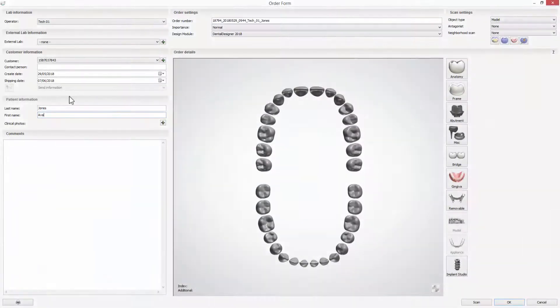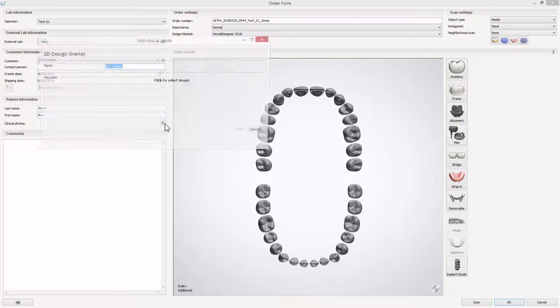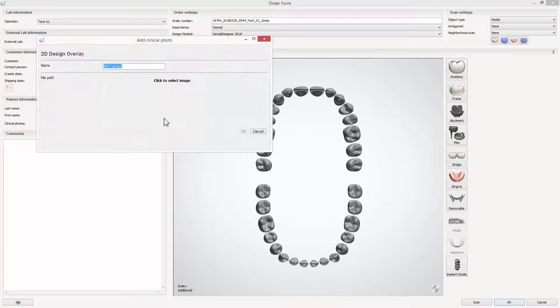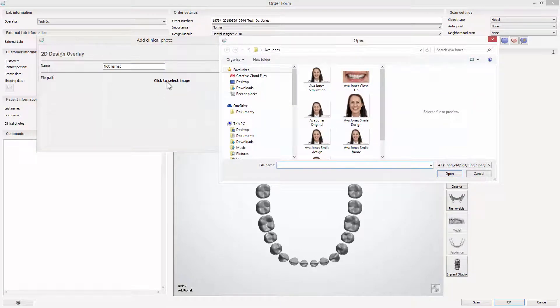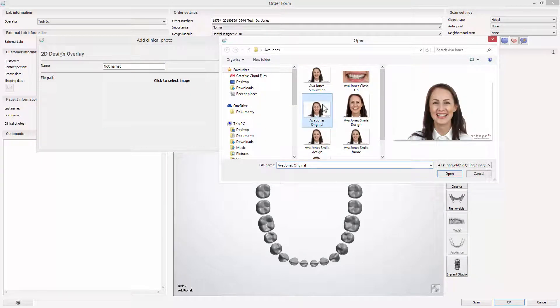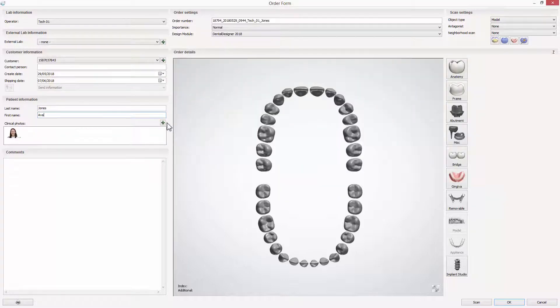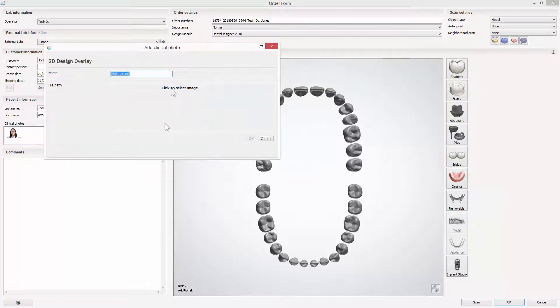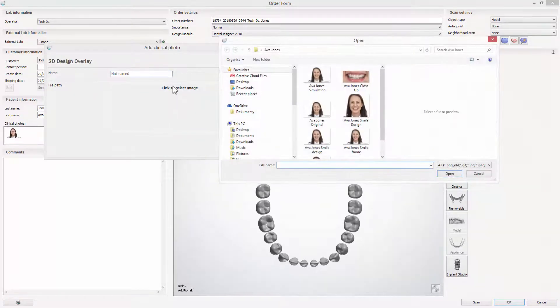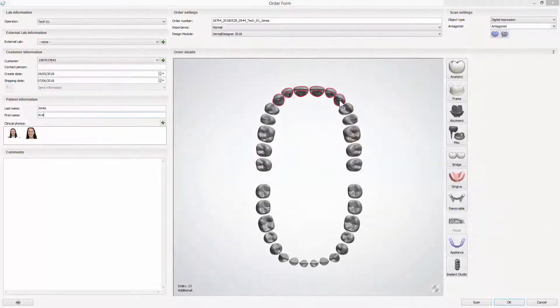When completed, move to the Dental System application. In the order form with the scans for the patient, add the pictures exported from the Smile Design application. Import the original smile photos and the one with the new Smile Design.